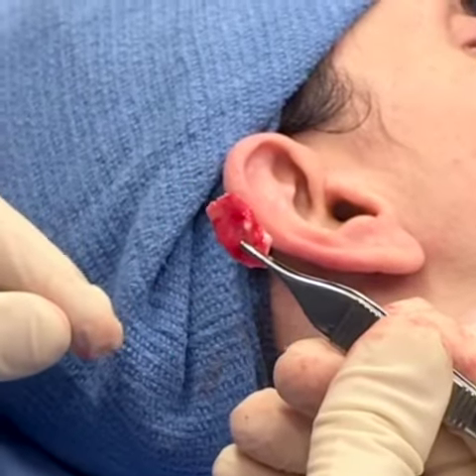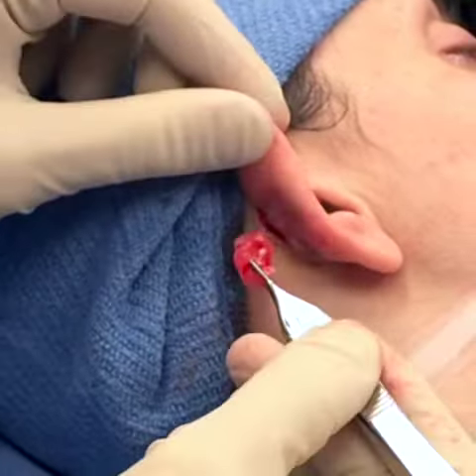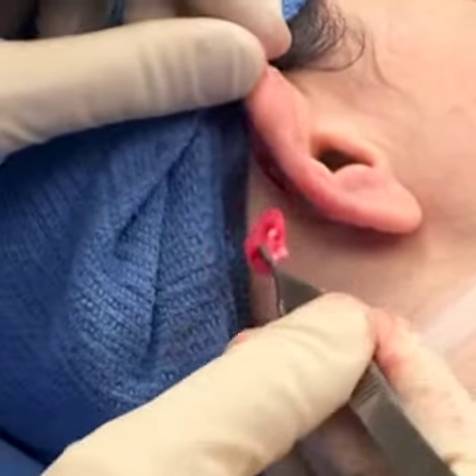This is a piece of cartilage that we took from behind the ear. The incision is right here behind the ear, and when we close it, it won't show.